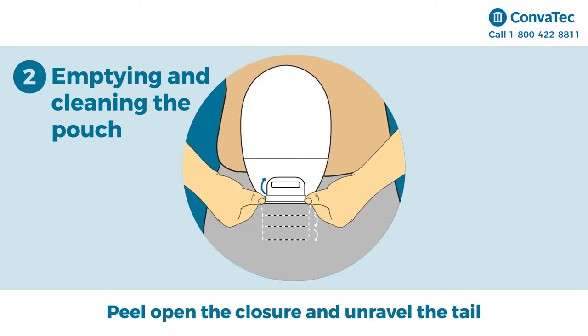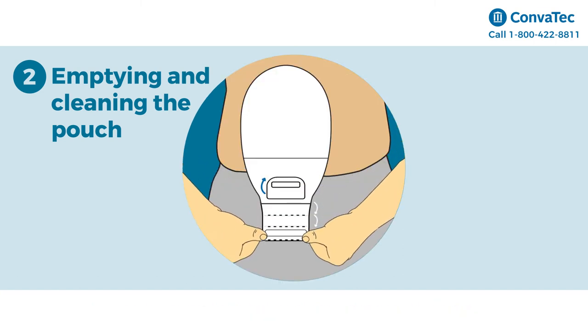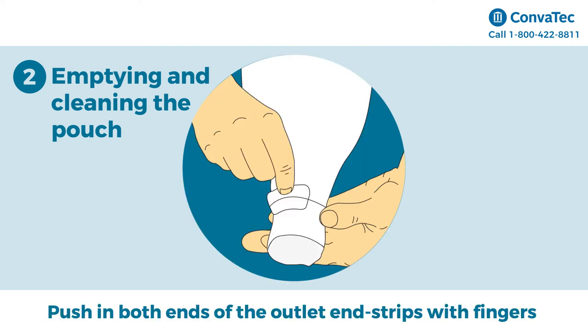Peel open the closure and unravel the tail. Unlock the pouch closure and open the tail by pushing in both ends of the outlet end strips with your fingers to drain the pouch.